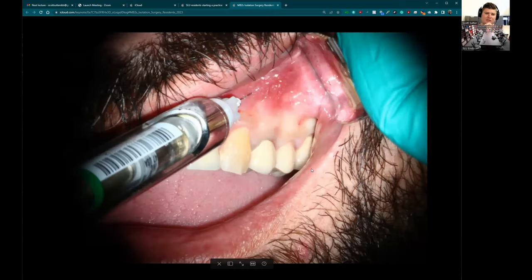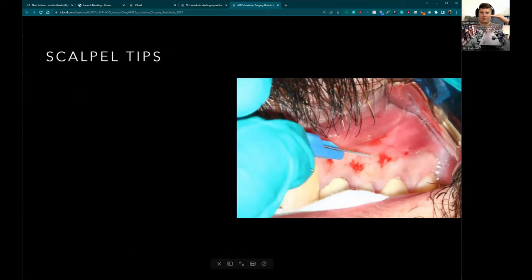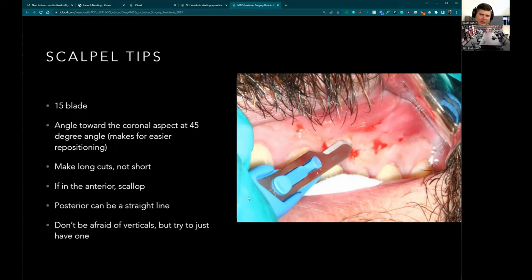This is what blanching looks like. I give about half a cartridge along where I'm going to make my cuts and the final half over the space where the lesion is located. A couple tips on the scalpel: you don't want to go in perpendicular to the tissue — you actually want to come in at a 45-degree angle. That gives you a larger flap to re-approximate more effectively, with more surface area to grab onto. Make nice long cuts — in the anterior scallop, in the posterior it can be a straight line — and use just one vertical incision.